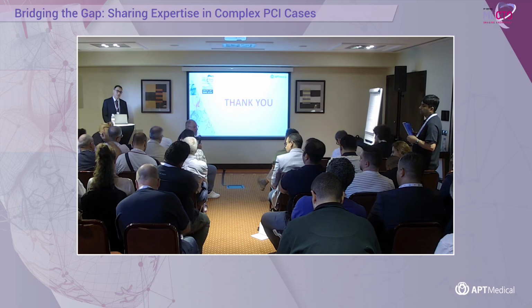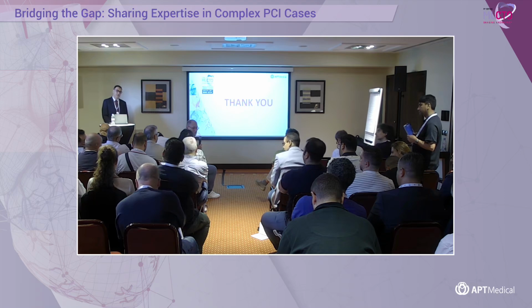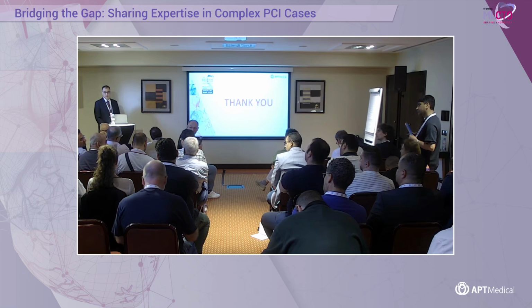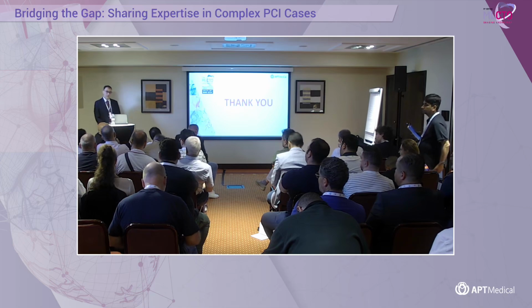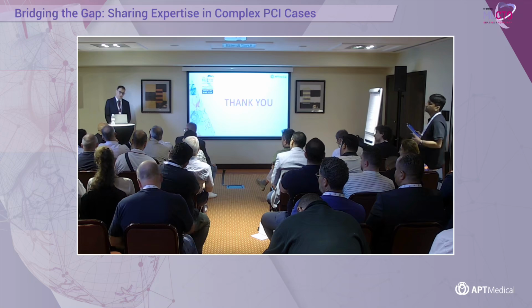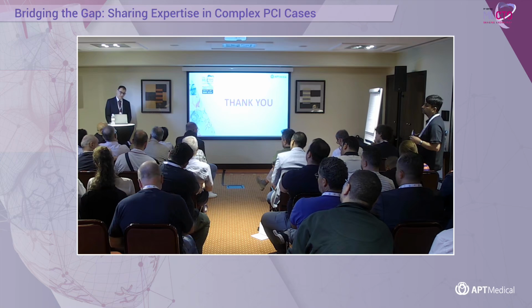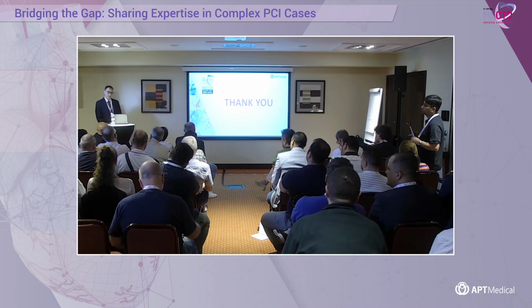And I don't know if you have experience, maybe at a time if the situation will be occluded again, the LAD could be a solution. Maybe. I don't know if you have experience. I think you have to also be careful because the flow from the LIMA into the LAD is very important. And if you try to close it and you fail, you will close the LAD. Yes, that's what's going to happen. Your native LAD will be gone, because whatever occlusion device, if you don't occlude it properly, it will migrate into the LAD and then you have a bigger problem.